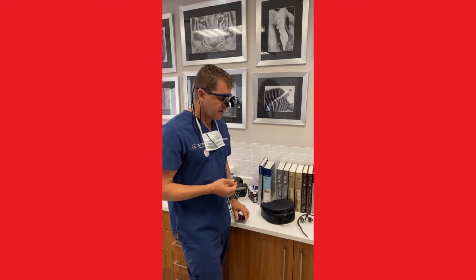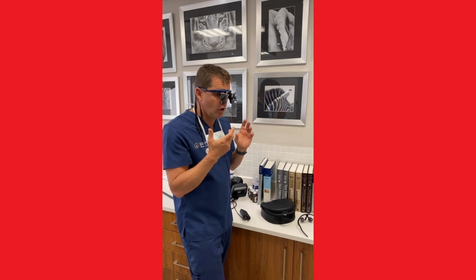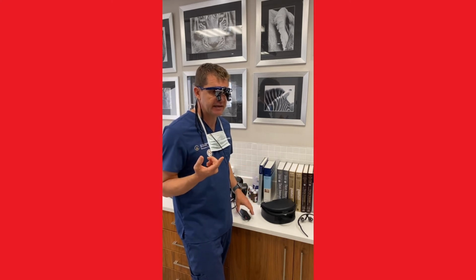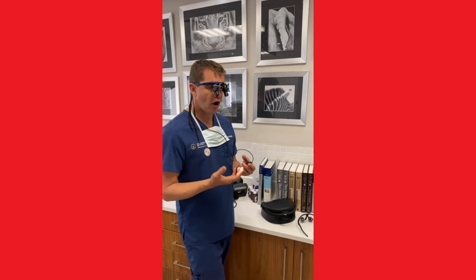The thing that then, if I've got my light source on here, it's on my hands, you can see that. Then what's interesting is, on the actual lenses, you turn them a lot more than normal to get which working distance you're at. So I'm at about 40 centimeters. So my first case I did yesterday, I was too low, as if I'm operating down here. The second case I brought up, I was far more comfortable.